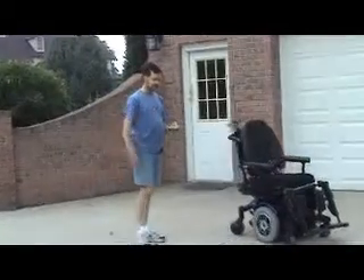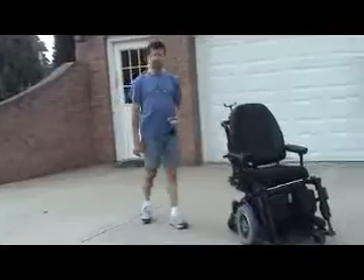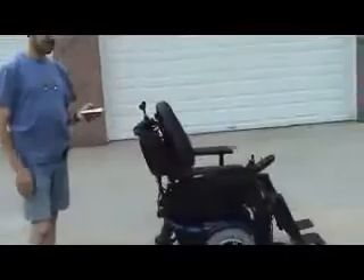It's in a right turn — I'll hit straight now. Now you can see the chair is going straight. I'll hit left. Now it's looping around to the left.